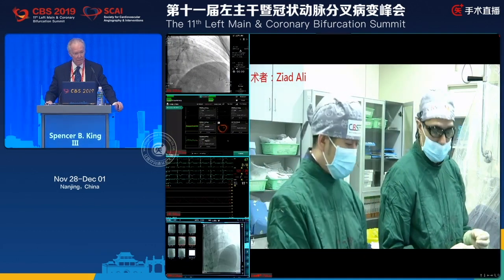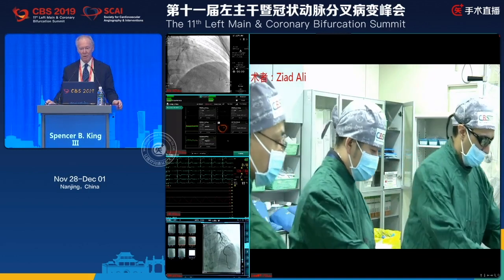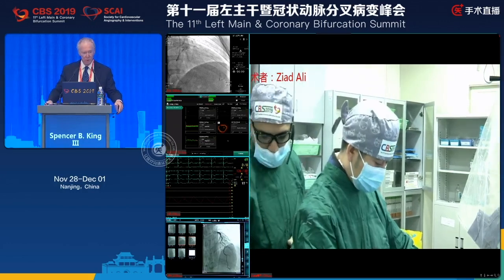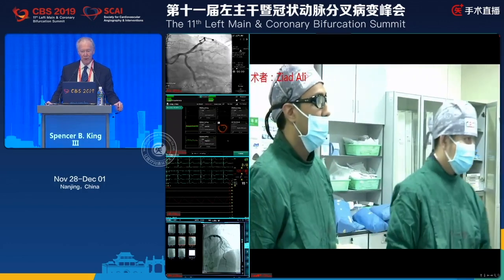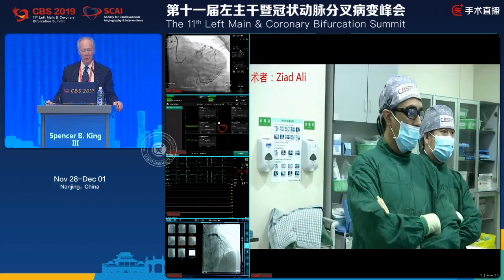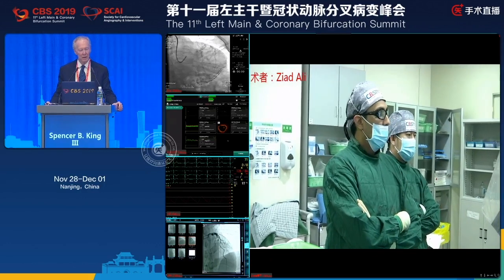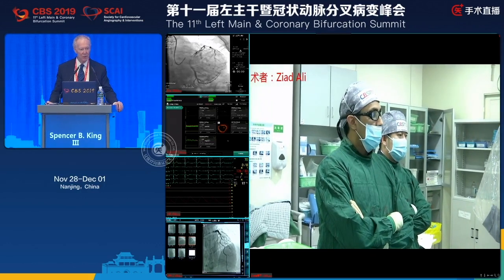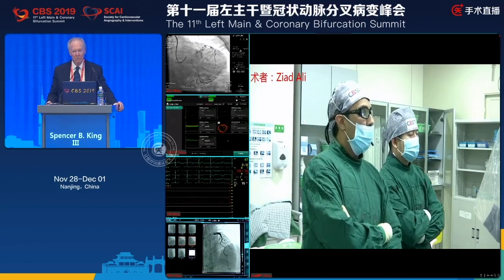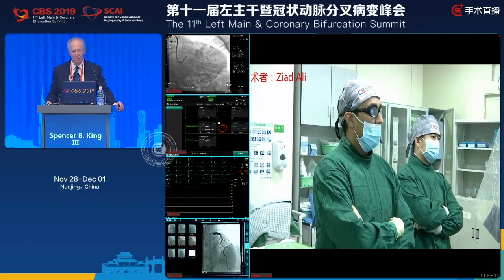Dr. Ali. Hi, Spencer, can you hear us? Yeah, we can hear you. So we're in a little bit of a stuck situation in the other room, so we're flipping over to you, and we have a number of questions about the case. I didn't have a chance to get more information, so tell us a little bit about what happened. This patient came acutely and had something done to the right coronary, is that correct? No, so the patient came acutely with chest pain, and the only lesion that they identified was an ambiguous lesion in the LAD and a very tight septal perforator.